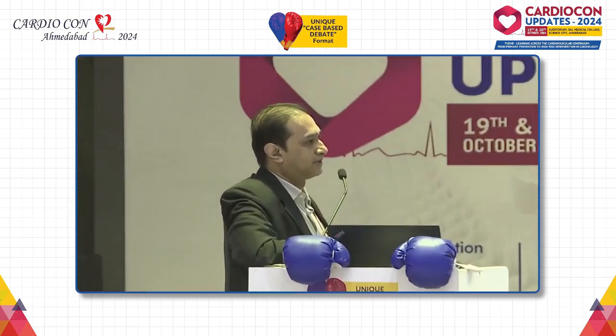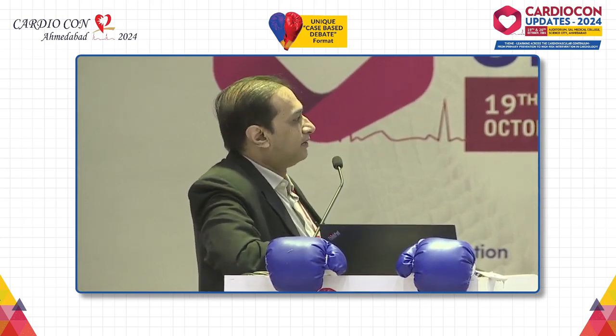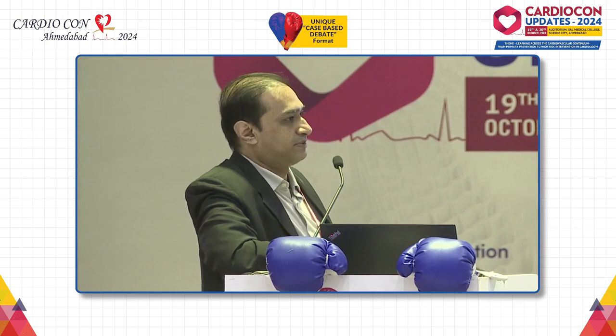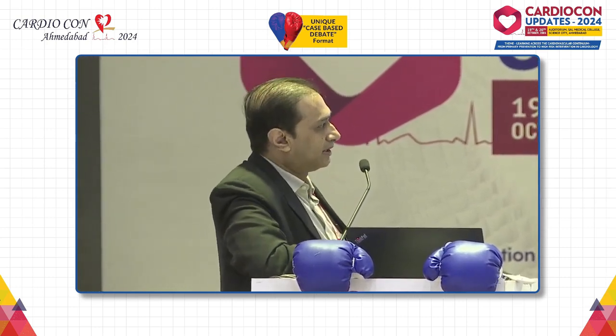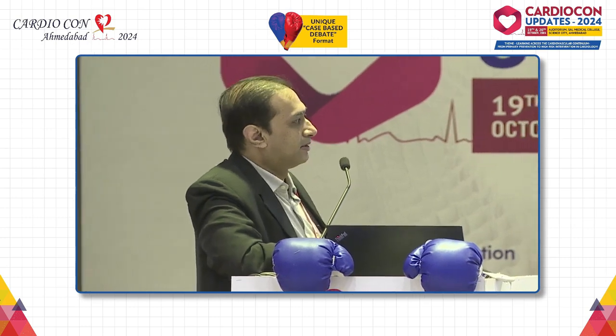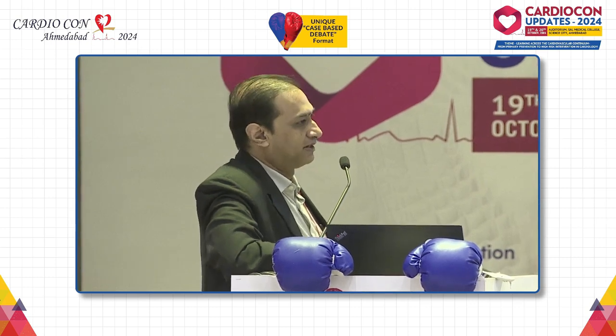Yeah, so I think real-world controversies come when the LV dysfunction is not as per the guideline cutoff. If this patient has an EF of 30%, you know that it's going to end up with a CRT-D. If the patient had an EF of say 50%, you would not even debate about CRT-D. Again, if you have a huge scar burden, say 20% of the myocardium, you think of an ICD.